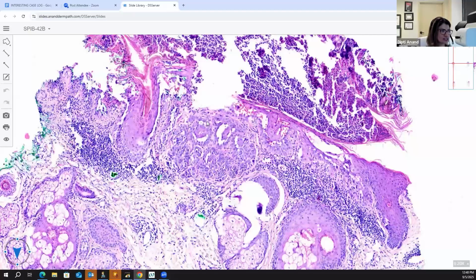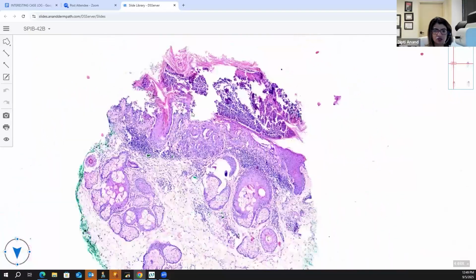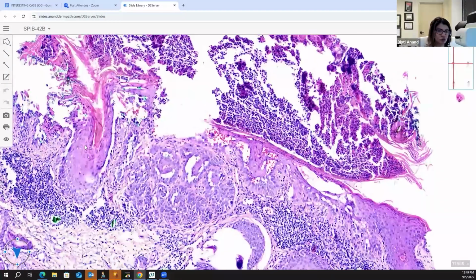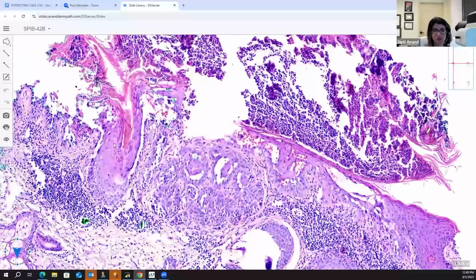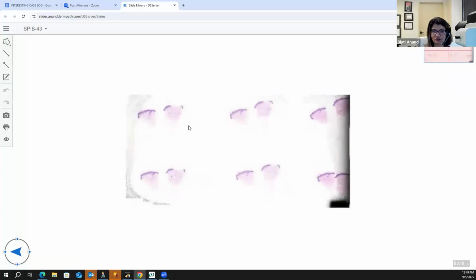And that's the reason. I forgot there is a 42B, which was representative of the patient. This is the same patient. And here you can clearly see, and probably this biopsy has been taken from maybe an intertriginous site, where it is eroded and crusted, and you can see the follicular involvement. So this is Darier disease. You're absolutely right, because there is clearly involvement of the hair follicle. Yes, but if you just had that slide, you would favor Grover's. Okay, great. That was a trick for me.